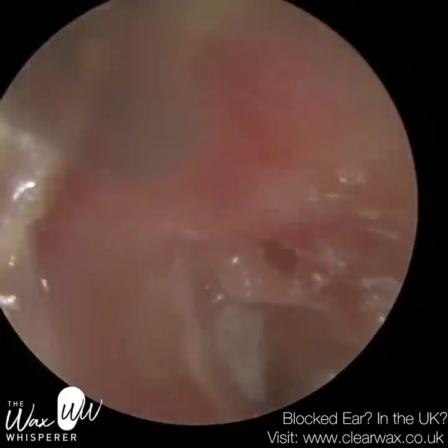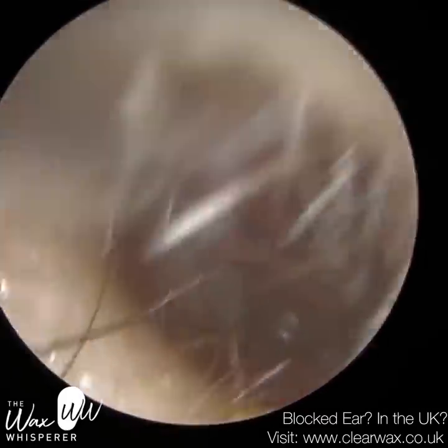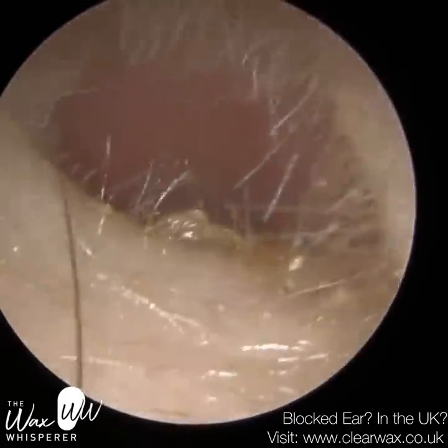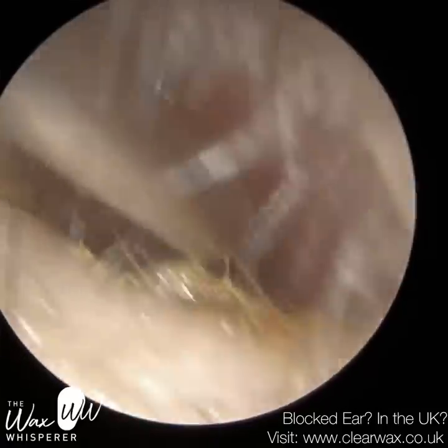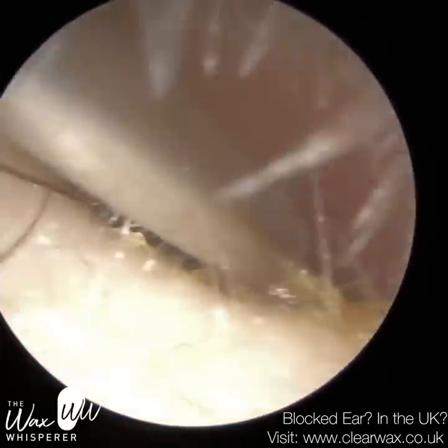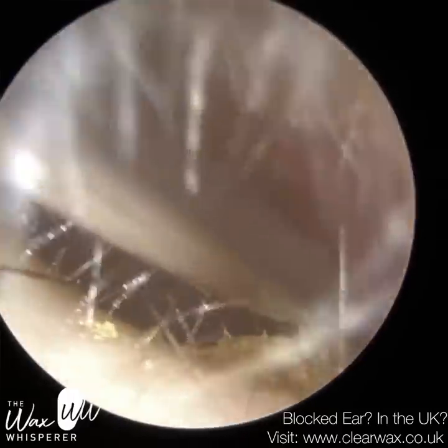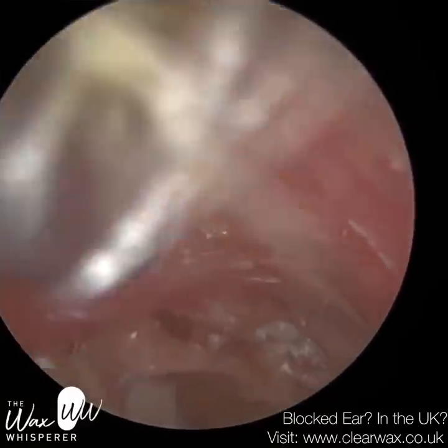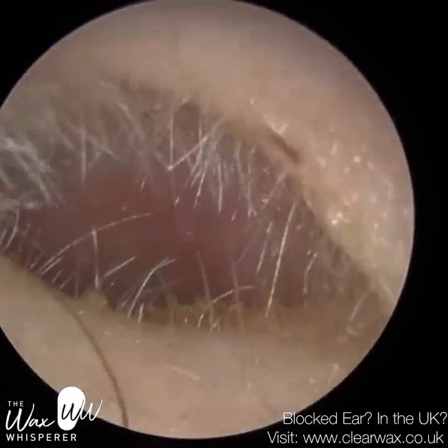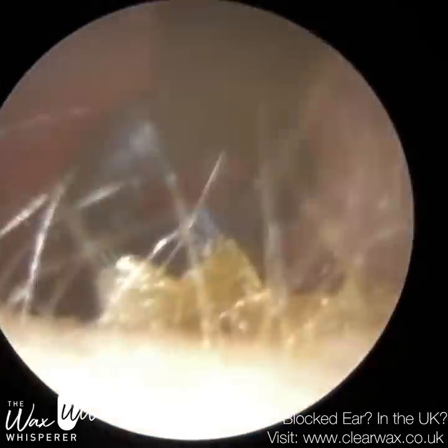That region is actually called the pars flaccida for that reason. When that eardrum gets pulled inwards, it creates a pocket and dead skin can get trapped. The outer layer, the epidermis, is made up of skin, and as that skin dies and sheds it should move slowly off the eardrum, off the ear canal, and out of the ear. But if you've got a pocket there, the skin as it's migrating falls into the pocket, and it can form into a plug of dead skin, then into a cyst — it can get infected and cause a whole host of problems.